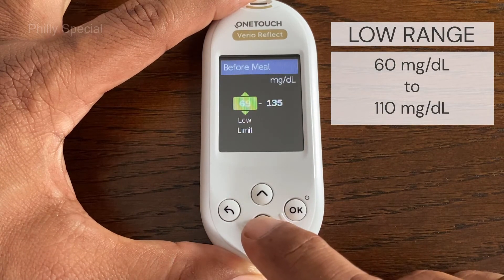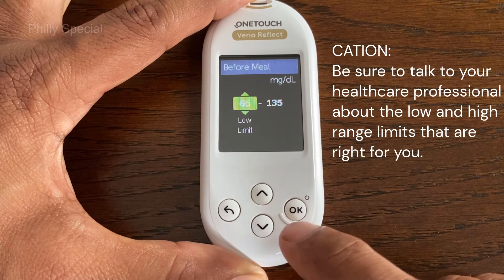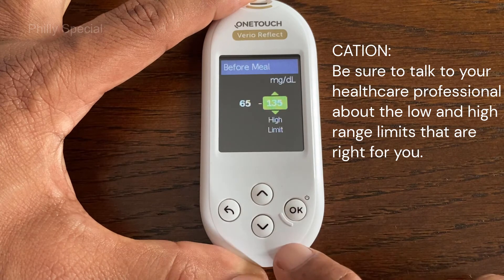To edit the preset low range limit, press the up and down buttons to change the value between 60 mg/dL and 110 mg/dL, and then press OK to confirm.